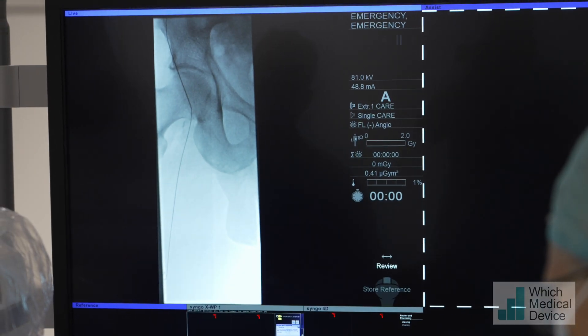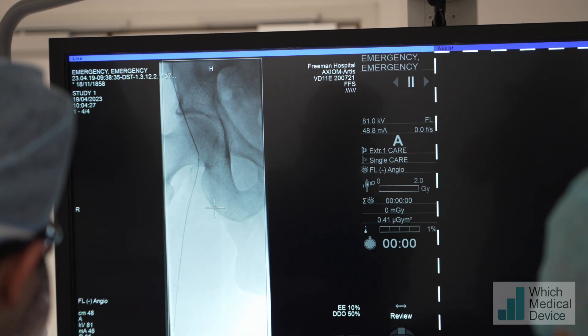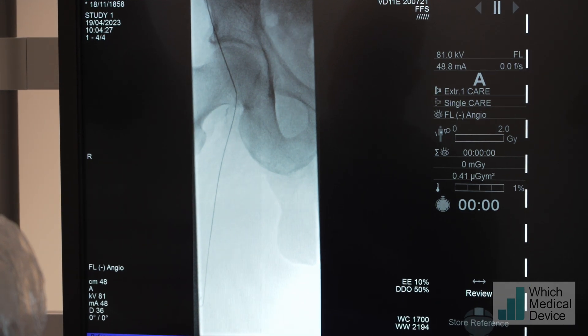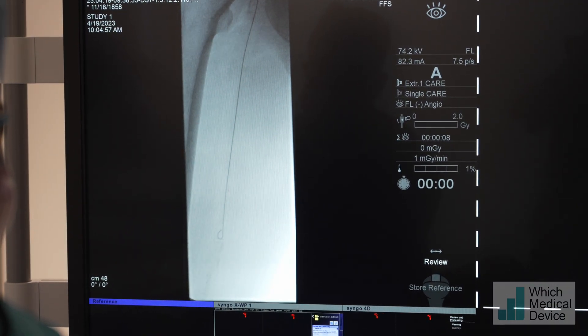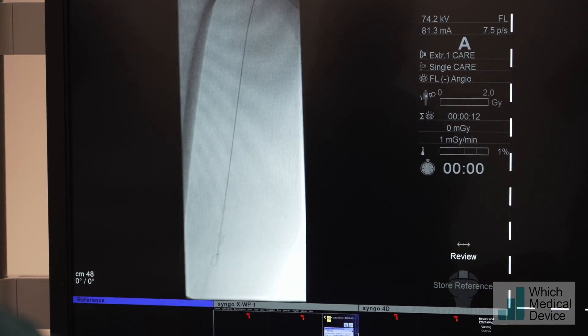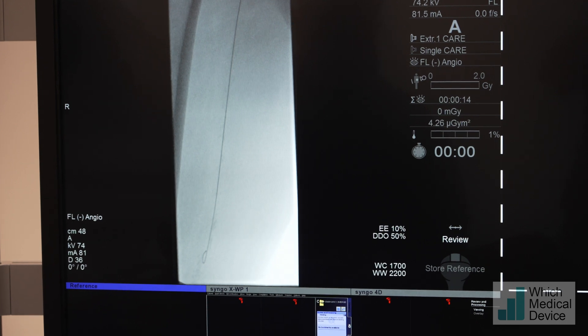Let's have a look at the puncture site - that looks good. The puncture is on the femoral head and the wire seems to be flying down in the direction of the SFA, so we'll just move a little bit lower down. I'm just looking at the tip of the J to see if it deforms at all, which would show us there is some sort of narrowing or occlusion - and at the moment it is not.